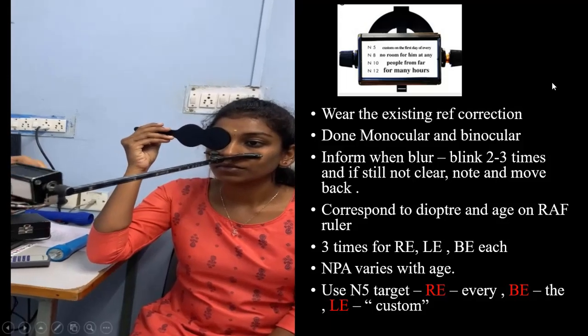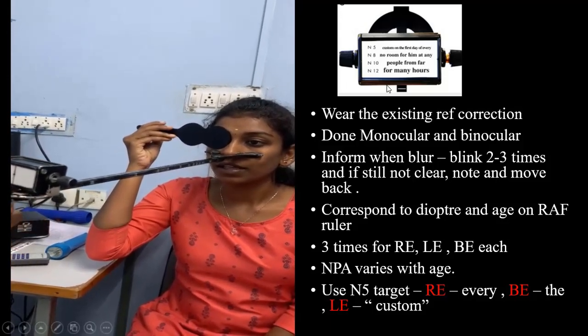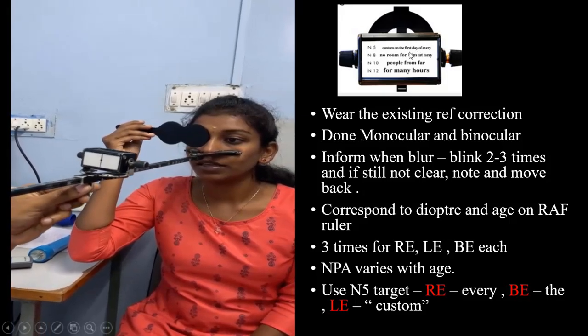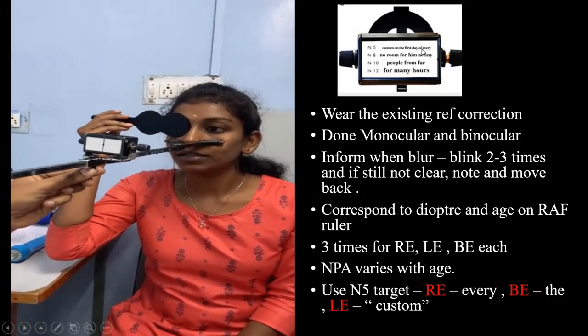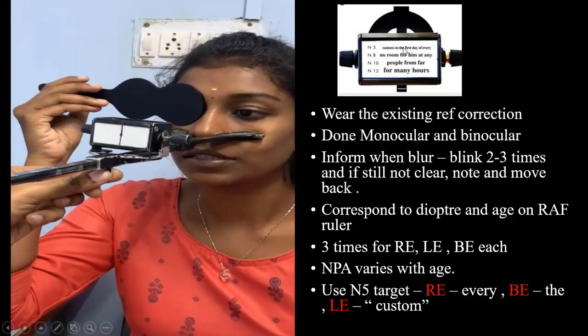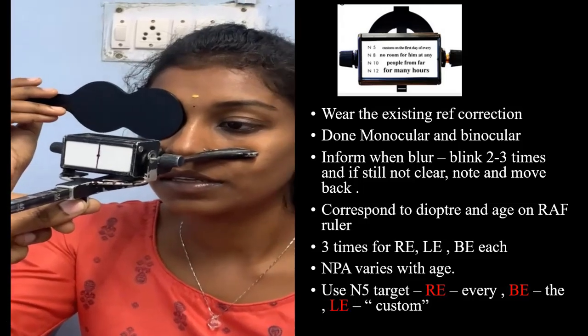So suppose we are using this target, the Times New Roman font as we saw, the N5 target can be taken. For the right eye, the word on the right hand side, "every", or on the left side, "custom", or for both eyes, the word "the" can be taken for noticing the blur.